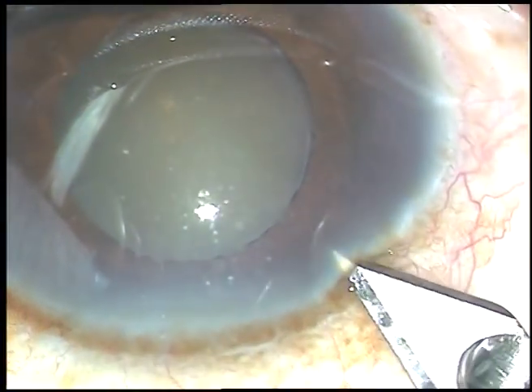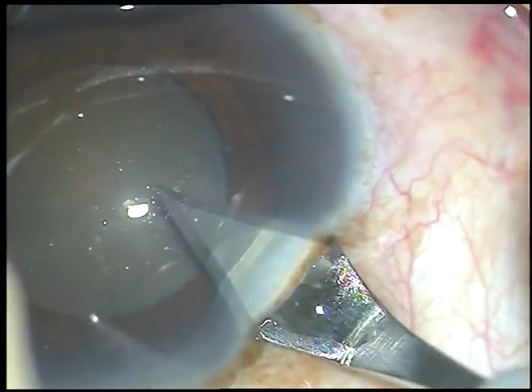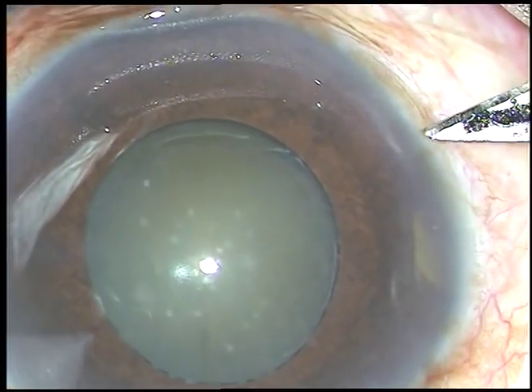This is the main incision at around 10:30 o'clock with a 2.8 mm keratome. And now one side port is being made at around 8 o'clock.